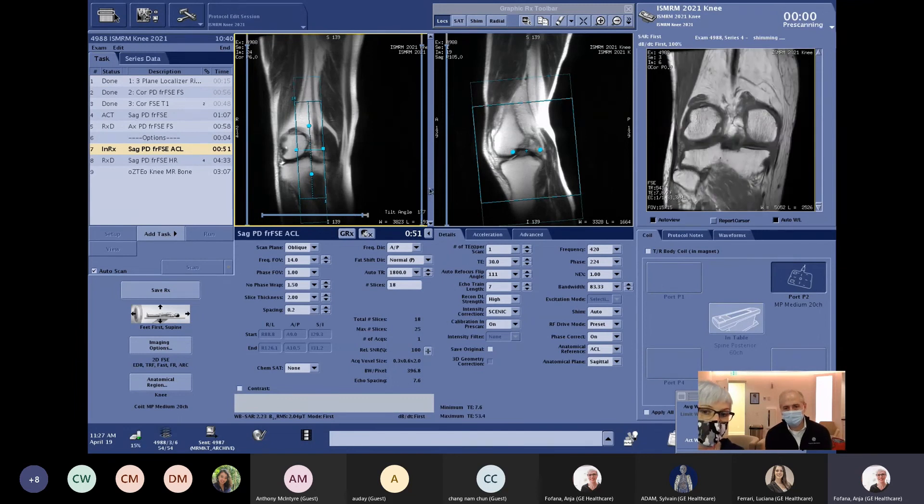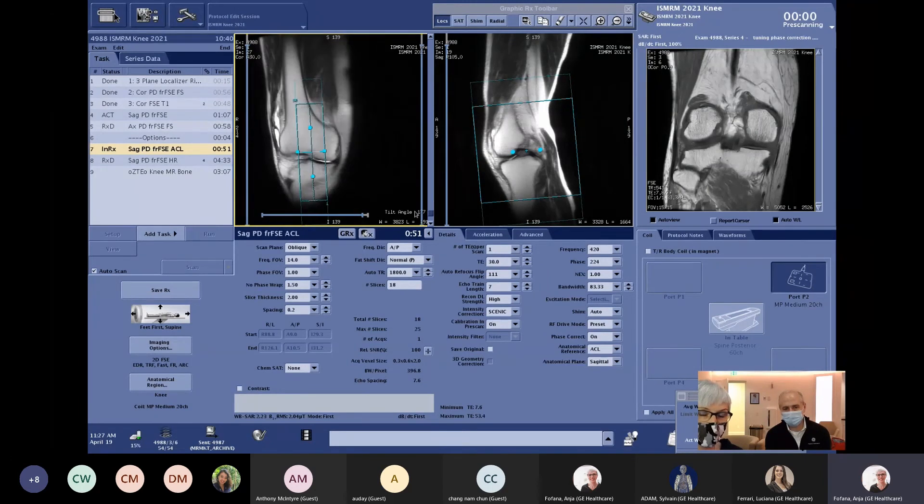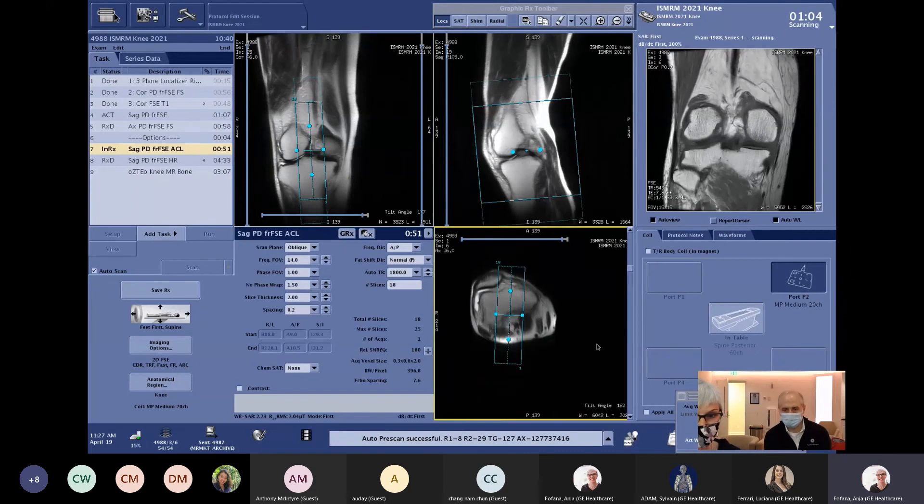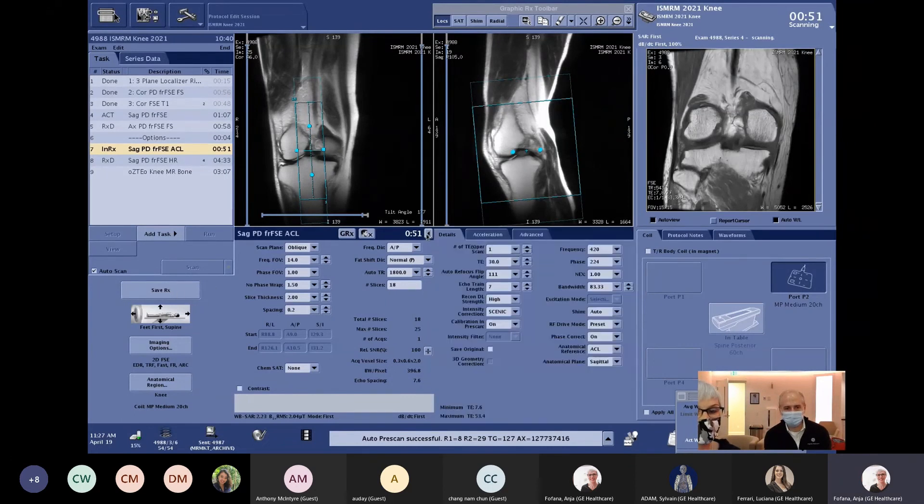Here we can show the slice prescription done on the ACL. You don't have to think about how your ACL goes through the right knee — the system does that for you. If you open up the axial report, you can see the tilt and angulation it used to find the ACL. It looks very accurate. We'll look at the images later on and confirm that.